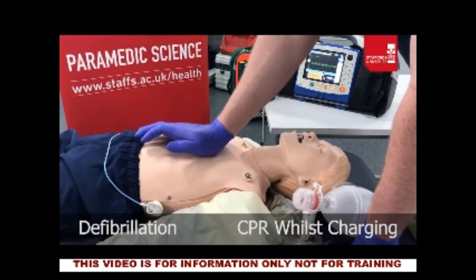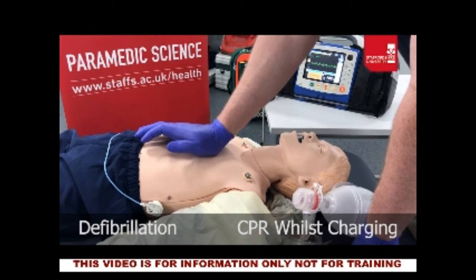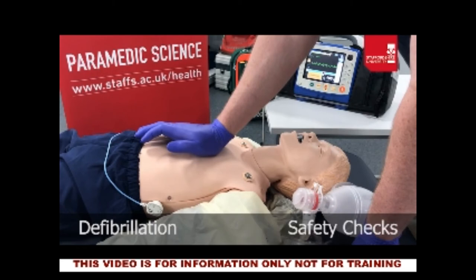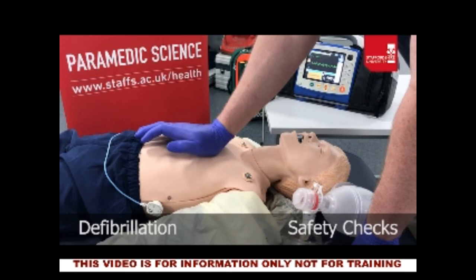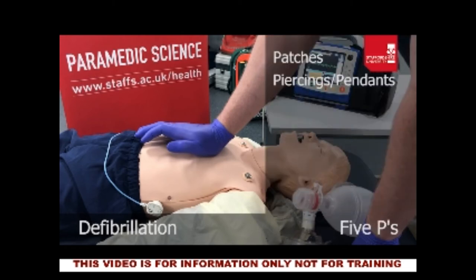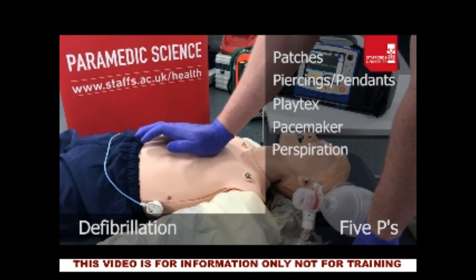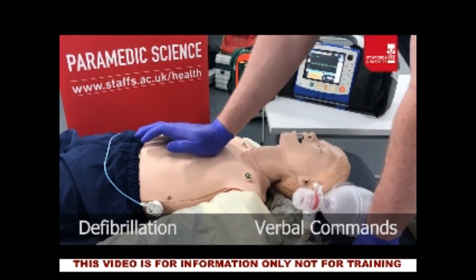With ongoing CPR while the monitor charges, we then need clear safety checks. This is your opportunity to make sure that everybody is safe — your crew mate and anybody else assisting with the arrest. This consists of environmental concerns — your 5 P's: patches, piercings and pendants, Playtex, pacemaker and perspiration. You are also going to need to give some clear verbal commands.